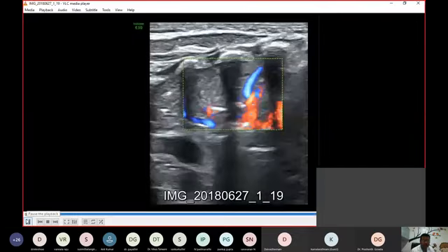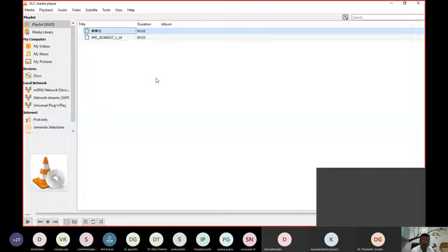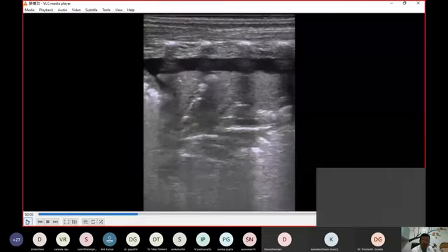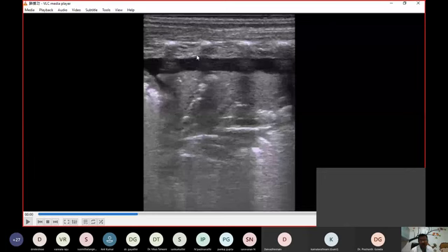So this is how the lung pulse appears. Just concentrate. I'll play it again. Just look here now. I have paused it. I'll play it again. There is some effusion here. I'll tell you how effusion appears. You can see air bronchograms. It's a shred sign, consolidated lung, tissue-like consistency here. Now look at the parietal and visceral pleura. This is the parietal pleura, and this is the visceral pleura, and you see how they are moving with each cardiac beat. That is what we call a lung pulse.